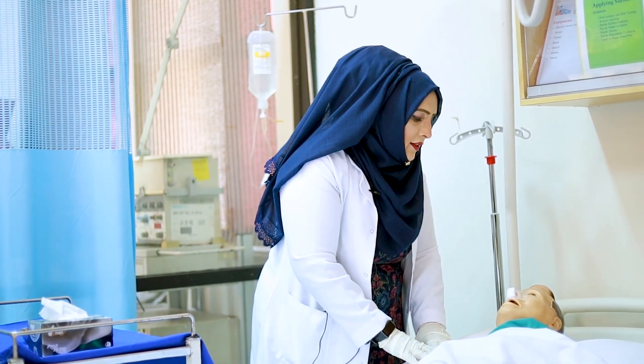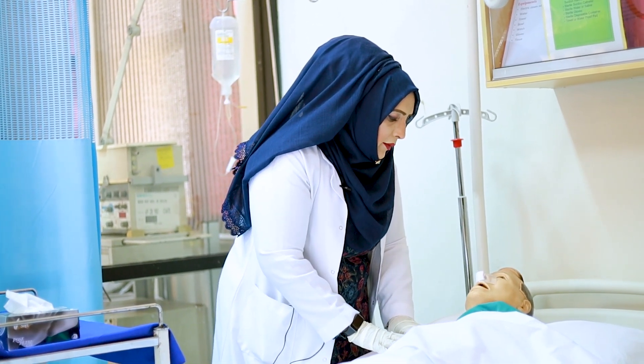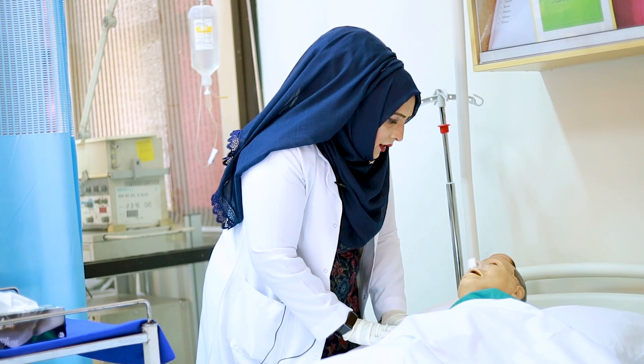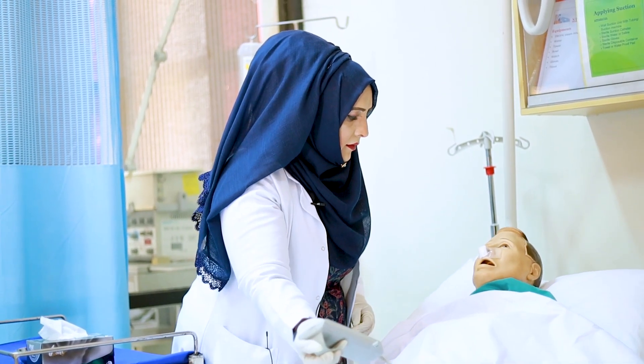Assalamu alaikum, Mr. Ali, how are you feeling today? I am your nurse, Naseem Arfiq, and I want to remove your nasal packing. Do you allow me? Thank you, Mr. Ali. So I'll get you positioned first.